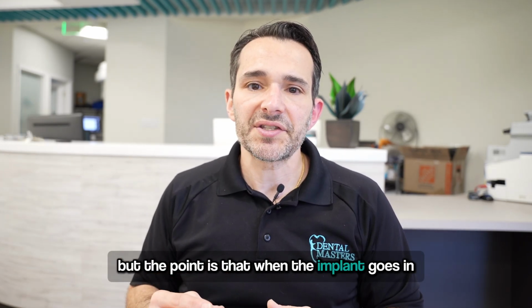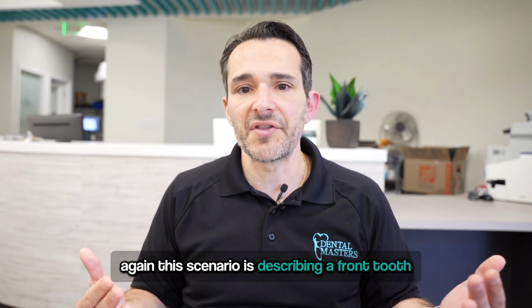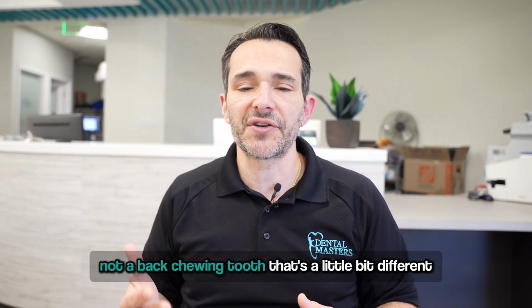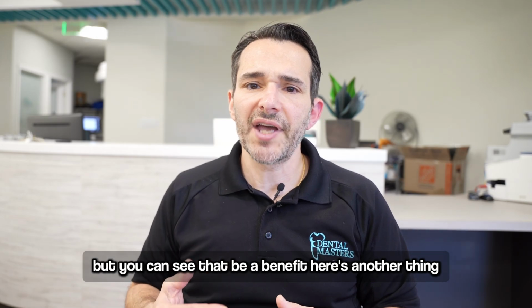But the point is that when the implant goes in, we scan it, print it out, and then we can just go ahead and screw the tooth in. Again, this scenario is describing a front tooth, not a back chewing tooth. That's a little bit different, and I don't want to go into the biology behind implants in this video. I have other videos that talk about that, but you can see how that'd be a benefit.